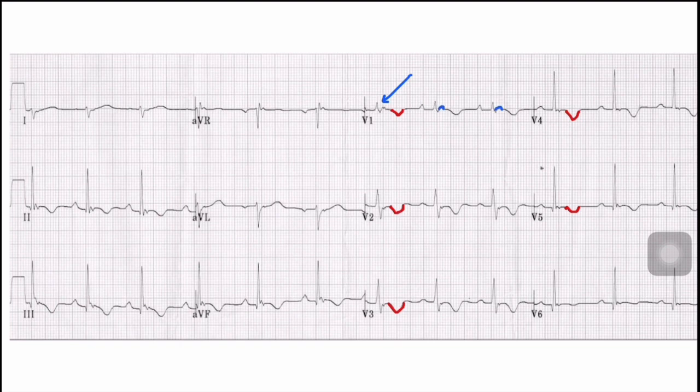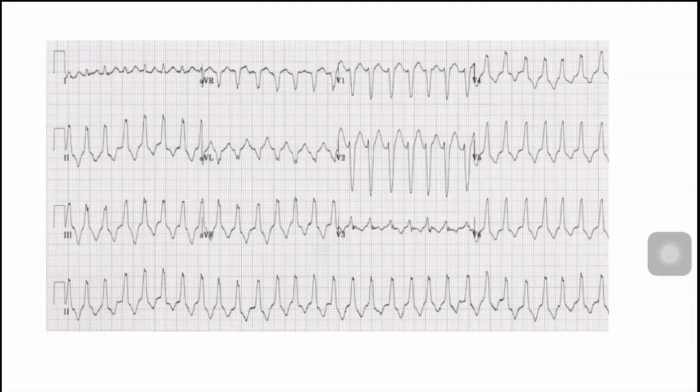The Epsilon wave is a positive wave after the QRS complex — that is, after the QRS complex there is again a positive wave, indicating delayed depolarization of the right ventricle.